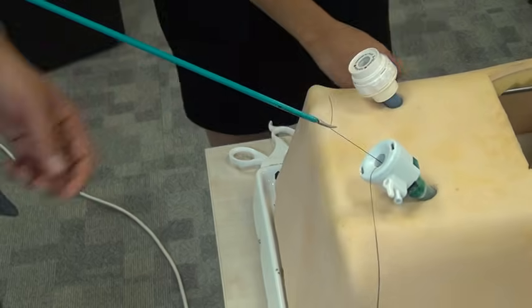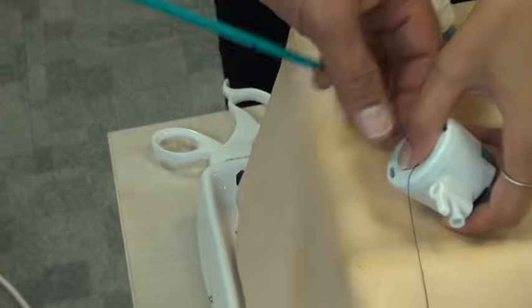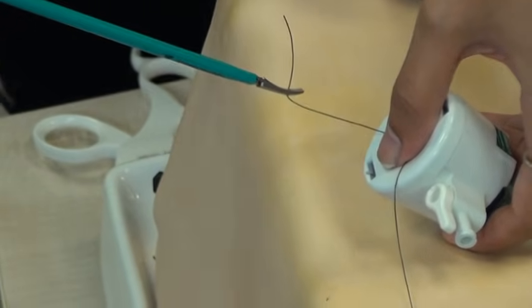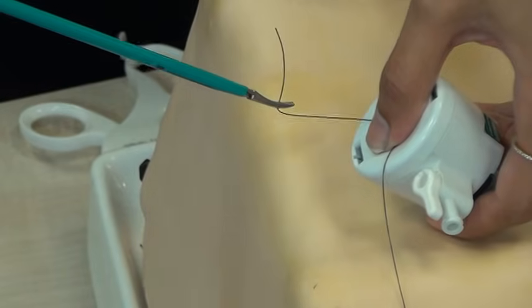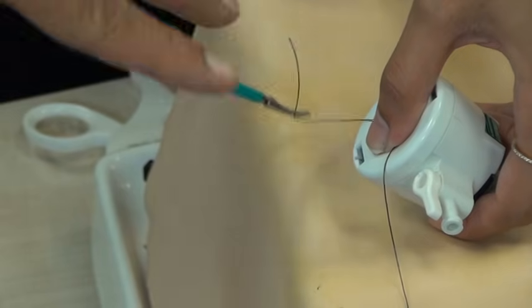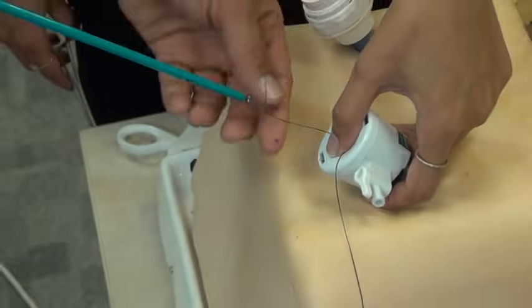Now get your assistant to put the thumb in the middle. So the idea is the thumb is covering the port from top to bottom, 12 o'clock to 6 o'clock, so that he or she is not in your way, separating the two limbs, right left and preventing any CO2 leak.